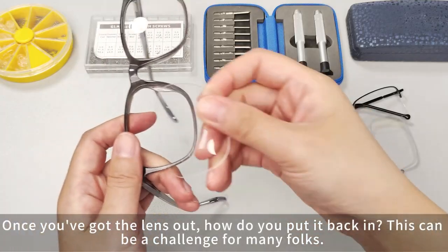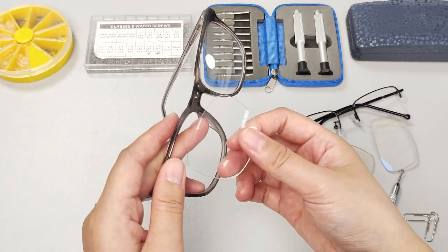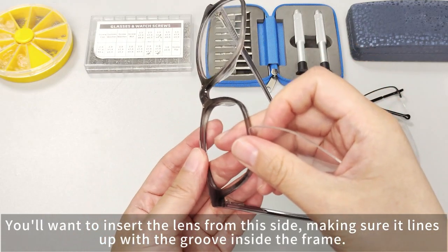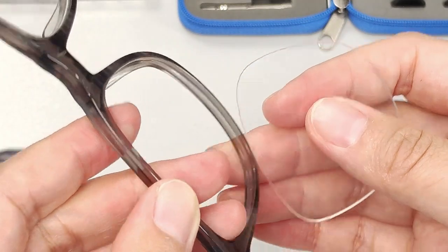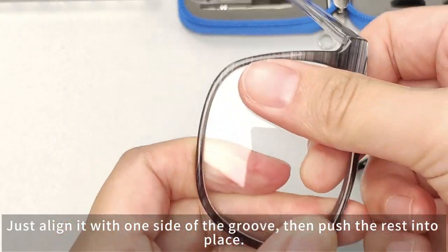Once you've got the lens out, how do you put it back in? This can be a challenge for many folks. You'll want to insert the lens from this side, making sure it lines up with the groove inside the frame. Just align it with one side of the groove, then push the rest into place.